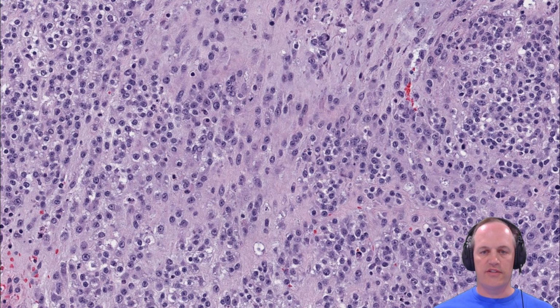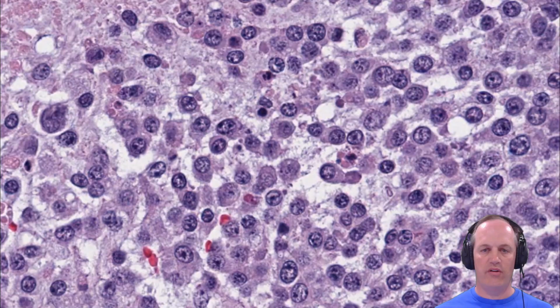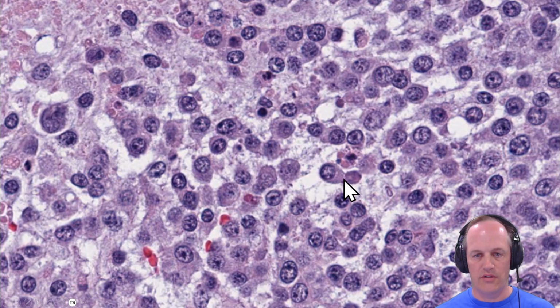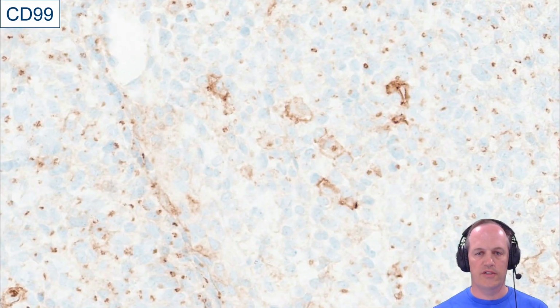But here's an area where you see that variation in cellularity. When we talked about rhabdomyosarcoma, we talked about embryonal rhabdomyosarcoma having variation in nuclear density and myxoid stroma, and here's that as well. You have this myxoid stroma, variable cellularity, so you kind of have features of Ewing sarcoma and rhabdomyosarcoma, and in fact, in this example, all these pictures are from the same tumor, by the way. And right here, here's some really rhabdoid cells with eccentric cytoplasm that's all on one side of the nucleus. So when you see that mix of histologic features, that's a good time to think about the CIC-rearranged sarcomas.